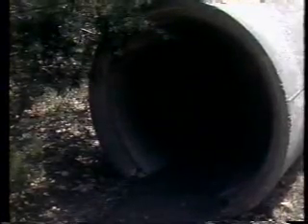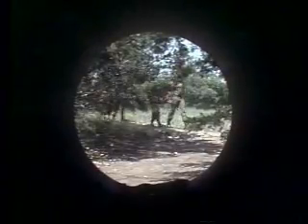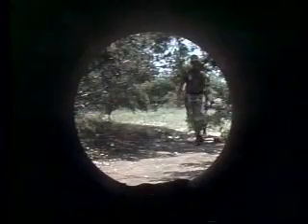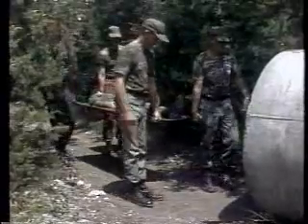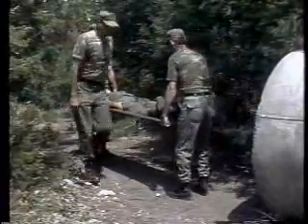Passing through a culvert pipe or underneath a ditch could pose a problem. For this, the team will use the modified 2-person carry. Here you see the team members turning and facing the patient, and then they're going to crouch low, not bending completely at the back, but also at the knees.